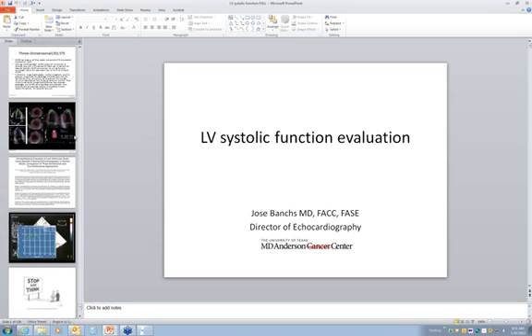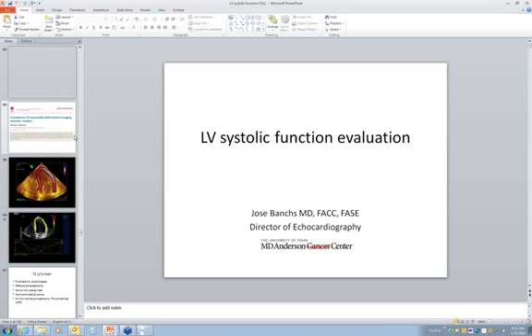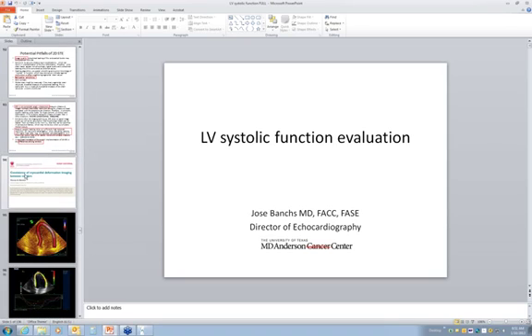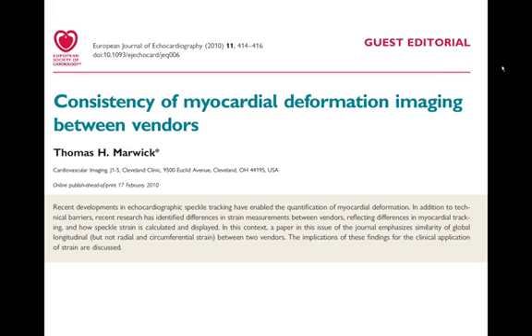I think that my question for them is if in the background the information is coming from a Doppler-based measure. That's what it seemed to me. And the Doppler, at the beginning, strain was done at a Doppler, and it proved to be too angle dependent to be reproducible and reliable. So that's why this was quickly improved to the use of speckle tracking protocol.